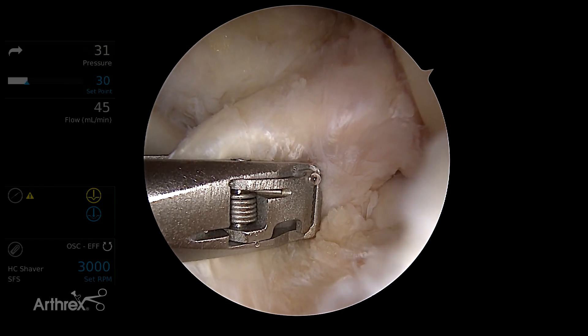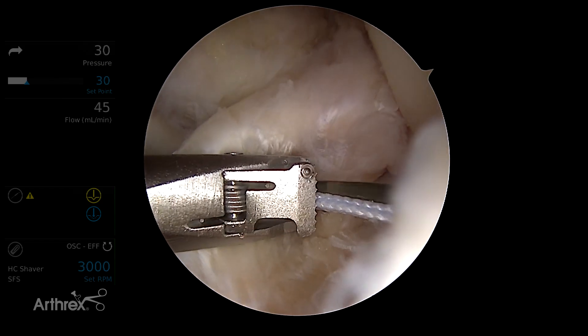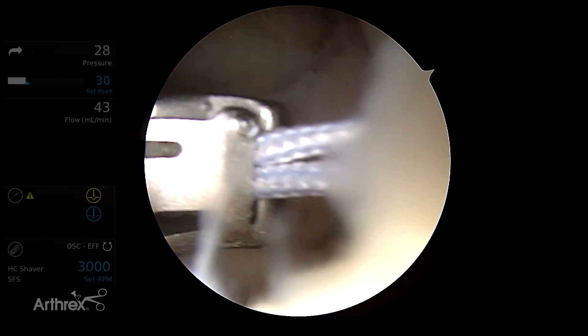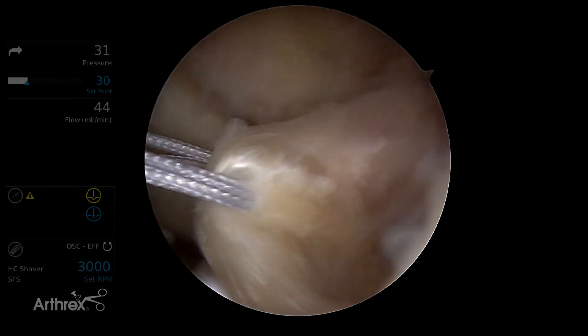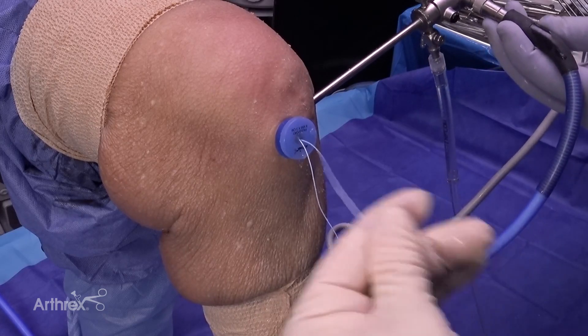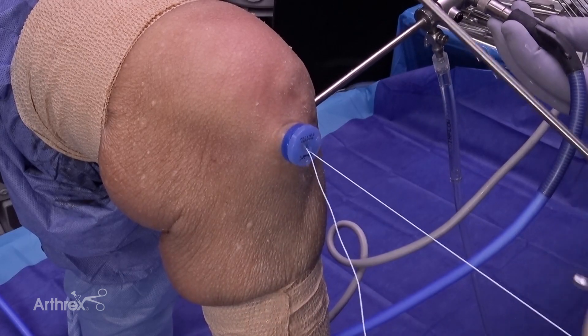You can try what you like, but we put fiber wires in the kit. This is a number two fiber wire. We take our first pass as low as we can on the ACL in the anteromedial bundle, and then we're going to bring it back through the passport cannula. Now we've got a single stitch going through.